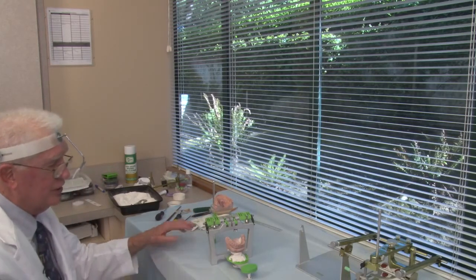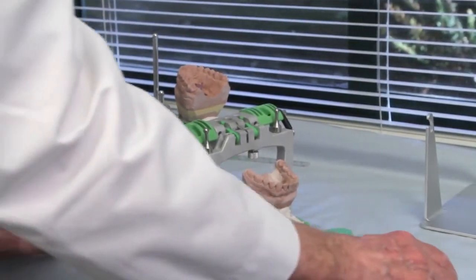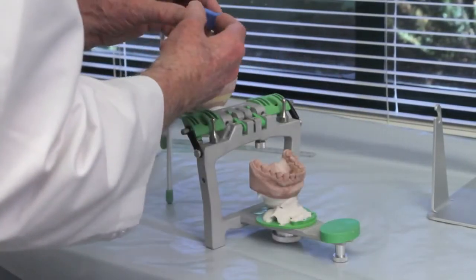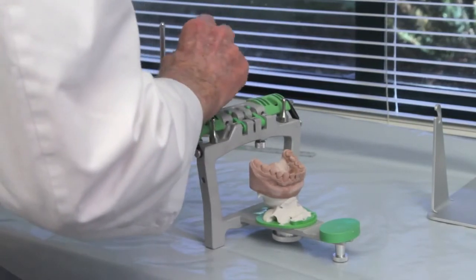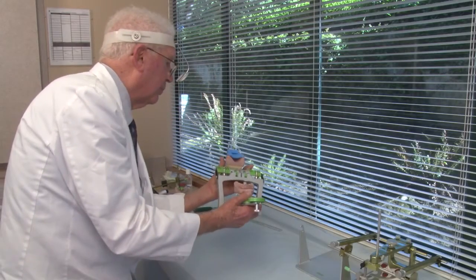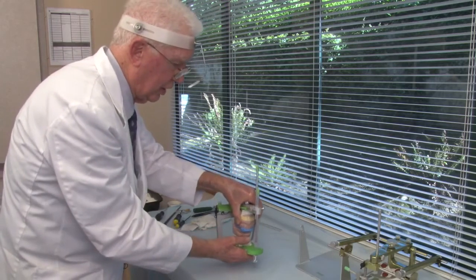Now what we find works easier is to put the wax bites on the upper model and then close the lower model into the wax bites that are on the upper model. So I'm going to place the wax bites again on the upper model. Make sure they're seated good. And then I'm going to take the articulator, hold the upper model with my fingers, and close the articulator into the wax bites. I'm going to invert the articulator.